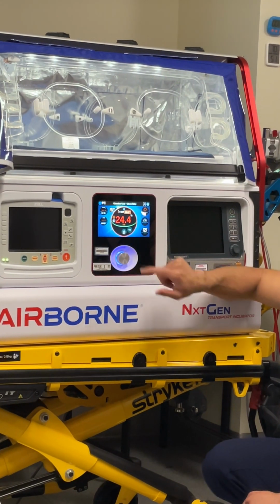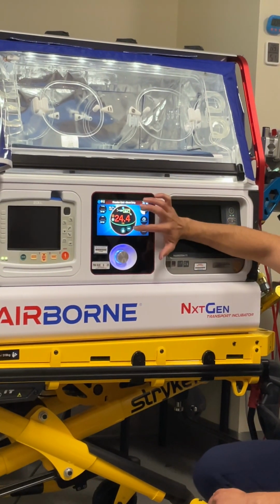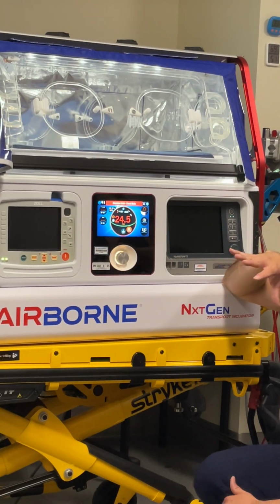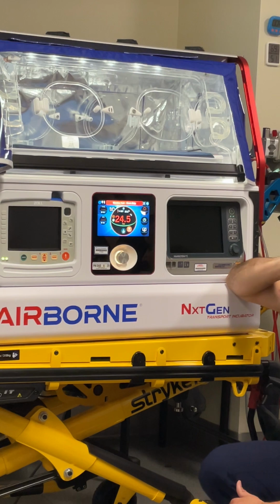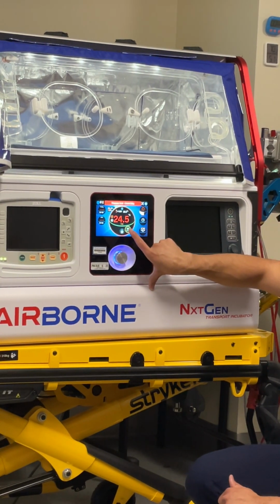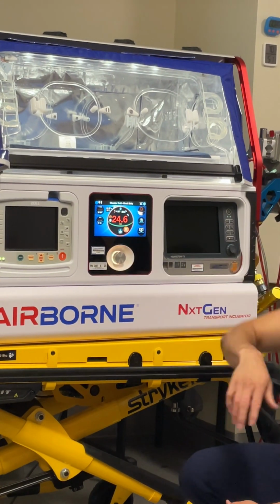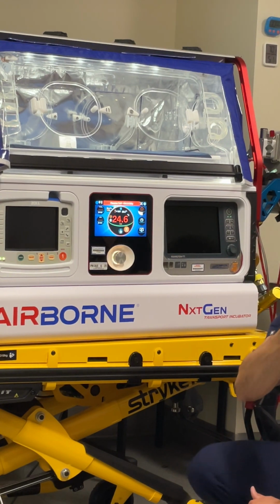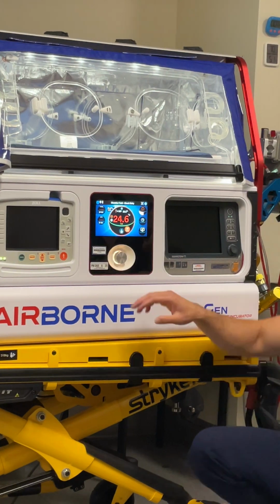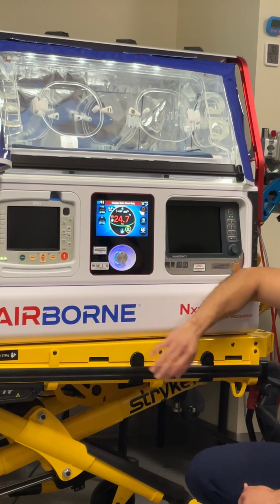When we're in the center bubble, I can now touch the suction. You'll notice the suction is a fair amount quieter than it used to be. So it's actually on in the back. You can only increase the suction when it's occluded. So when I touch the wheel to increase it, it won't go up unless something is being occluded to give you a reading. Because when we were doing it yesterday, we ended up going way too high because we didn't include it. They say the continuous suction? Yeah, it's just going to go.